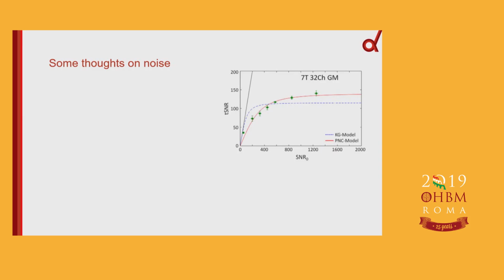Normally, when you reduce the amount of data you collect, you reduce your sensitivity, because you're just collecting data for less time. So mostly in fMRI, we get away with murder, because we can accelerate as much as we like in all sorts of wacky ways, and it doesn't affect our fMRI sensitivity. We're in the physiological noise regime.